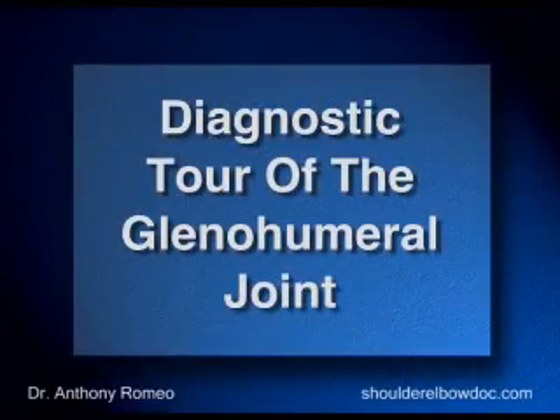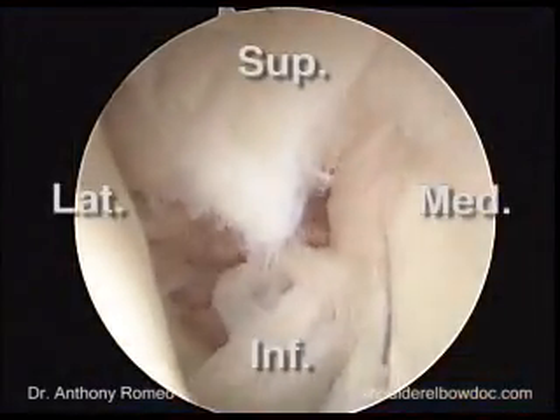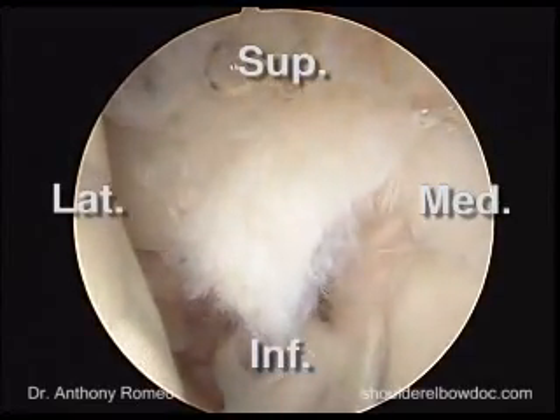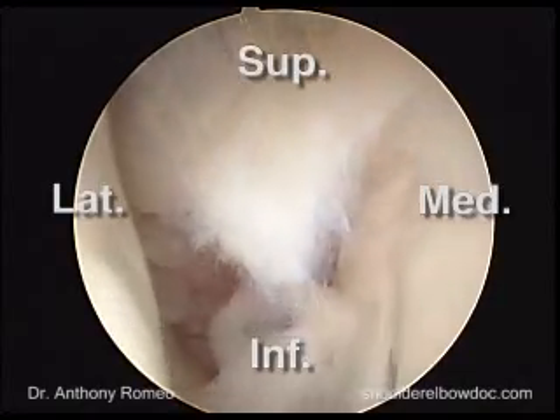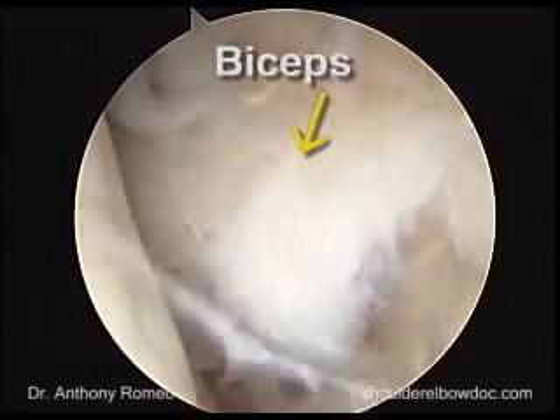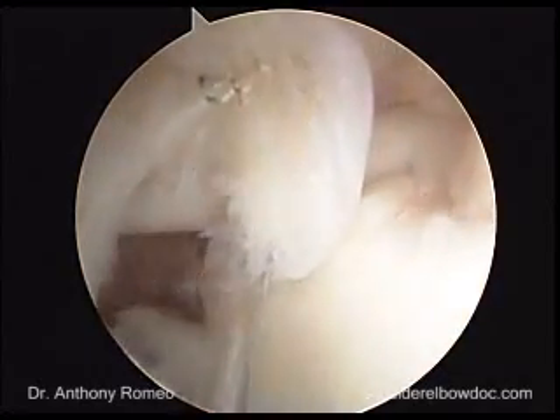Once we're in the glenohumeral joint, the first structure we're looking for is the biceps tendon. In this 59-year-old lady, we can see there's substantial damage to her biceps tendon, so it does not look normal. There's fraying of the biceps, and part of the tendon itself has rolled back towards the glenohumeral joint.